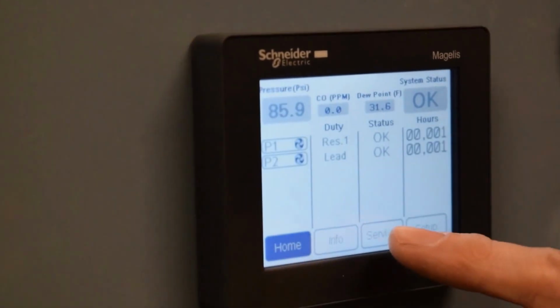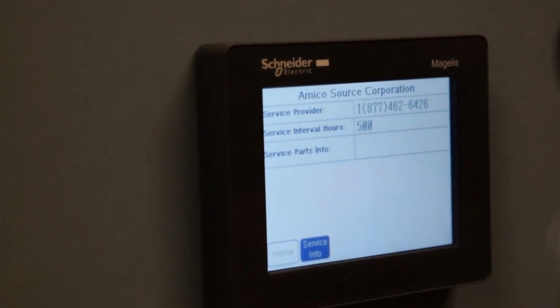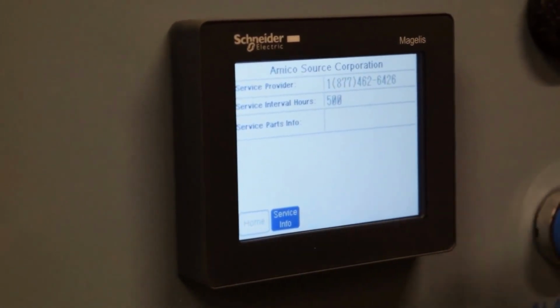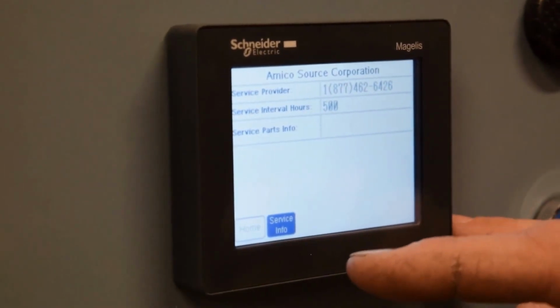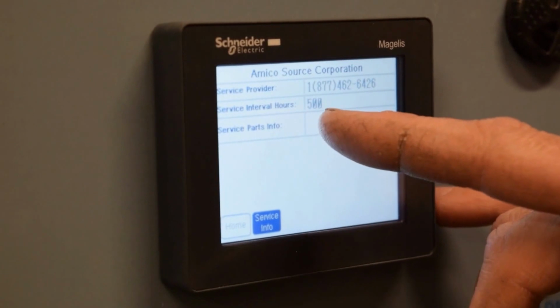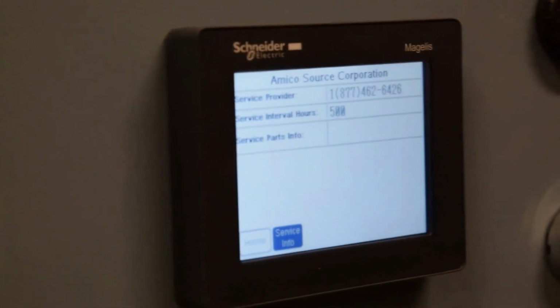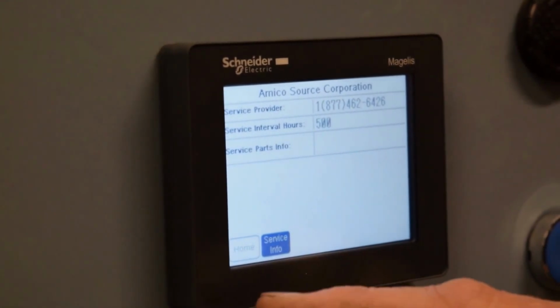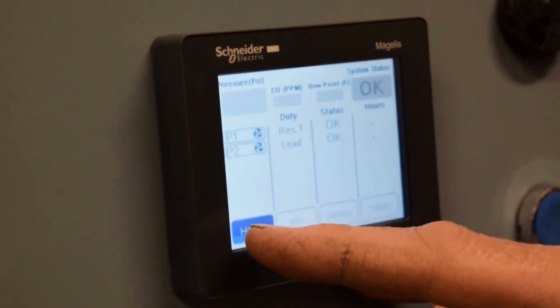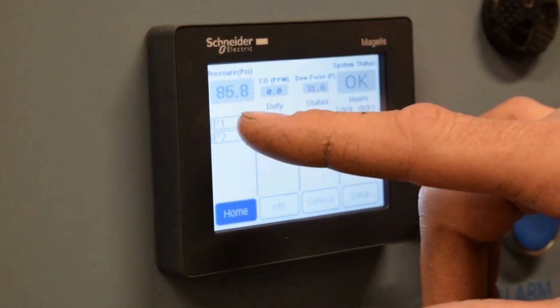You go back to home, you hit service. That's the 800 number for Amico. We are the authorized Amico service rep in the area. We would do the service if you wanted to contract service on the system. Not necessary, but if you want to, happy to do it. The service interval is 500 hours, so every 500 hours you're going to get a service reminder. At that point you're going to want to make sure it's getting serviced or service it yourself, but every 500 hours where it says status okay, you're going to get a service reminder.